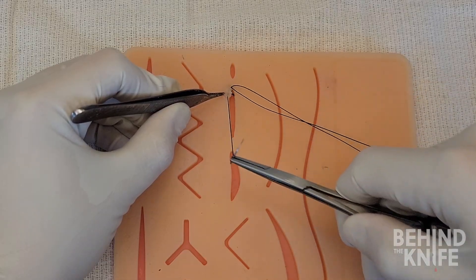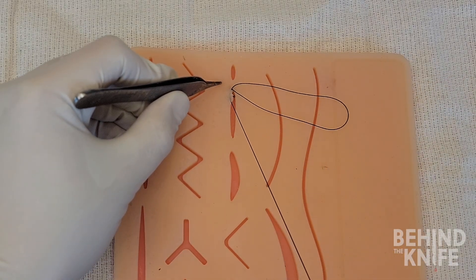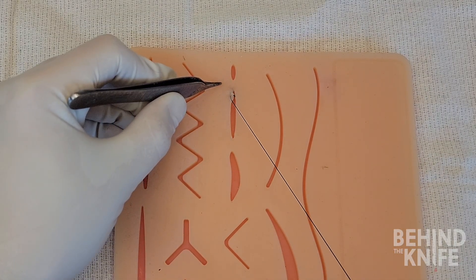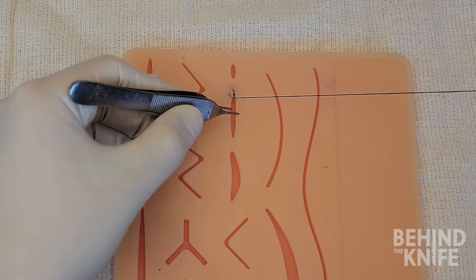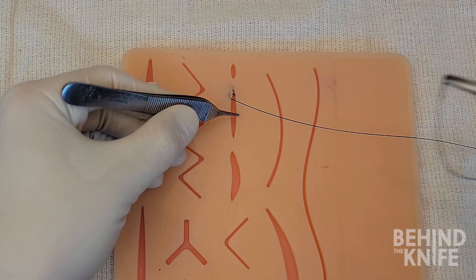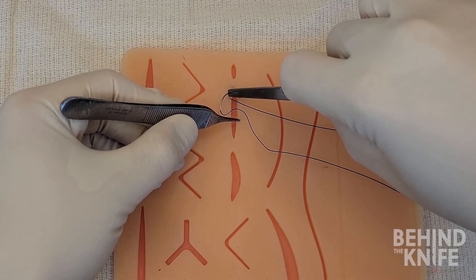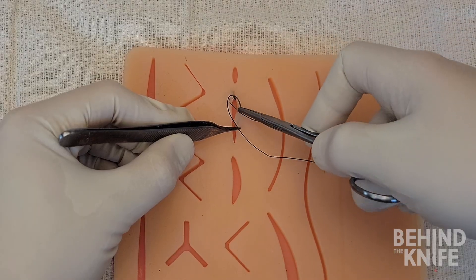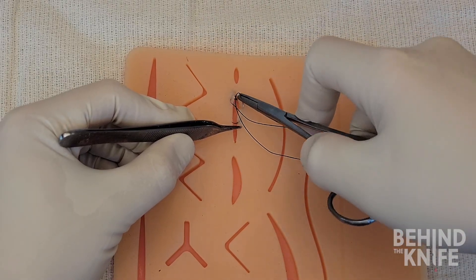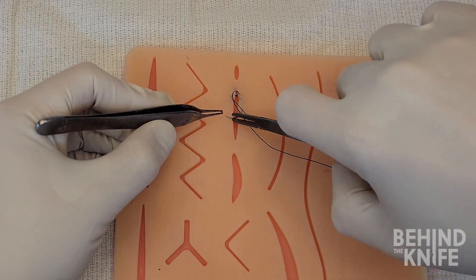Be careful not to evert the skin too much, as it is easy to accidentally come out through the epidermis. Every time we re-grasp our needle, we want to pull the suture tight which allows the tissue to come together.